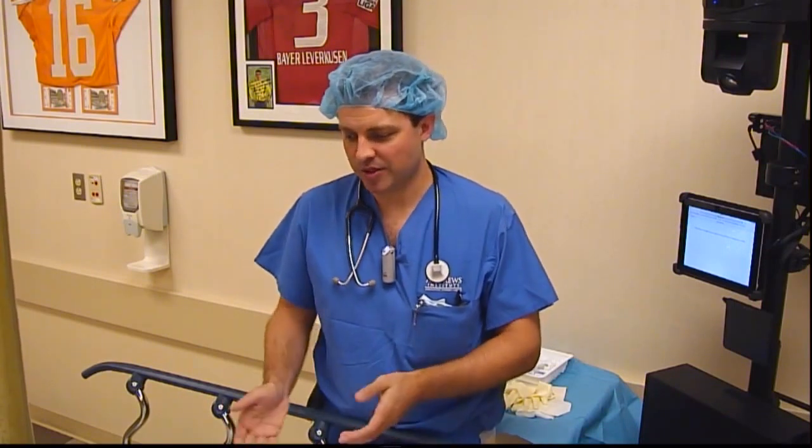Good morning, everybody. I'm back with another block of the day. I'm Brandon Winchester. Today, I'm going to be doing a right-sided adductor canal catheter for post-operative pain control, primary analgesia, following an ACL reconstruction with an ipsilateral patellar tendon graft.